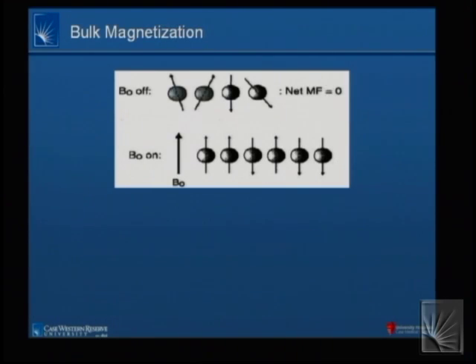But if I look at the situation where I jump inside the magnet, let's say I took Dr. Leparo and I took him over to radiology and I threw him inside a main magnetic field of a 1.5T scanner, how many of his protons are going to line up then? We have a completely different competition now, right? My main magnetic field is 30,000 times stronger. The competition that used to exist between the thermal environment of the body and the magnetic interaction between the proton's magnetic moment and the field, how many of them are going to line up? Almost none of them, okay?